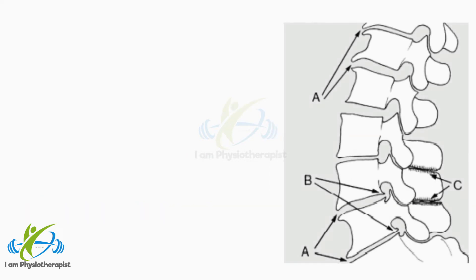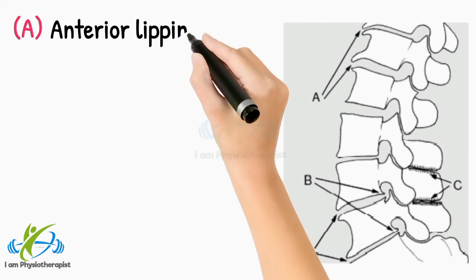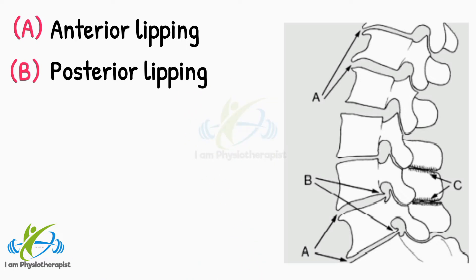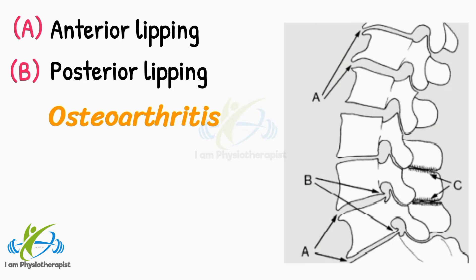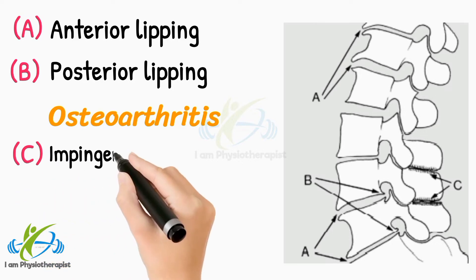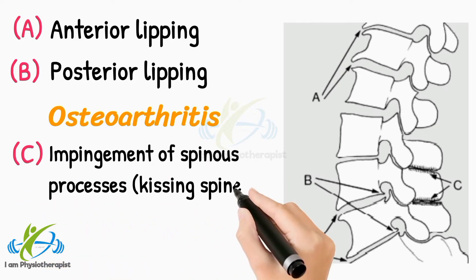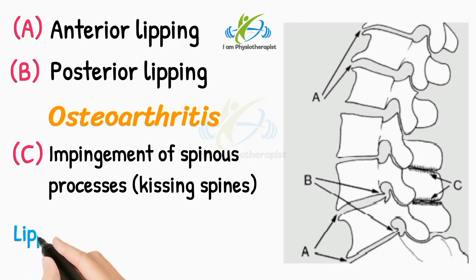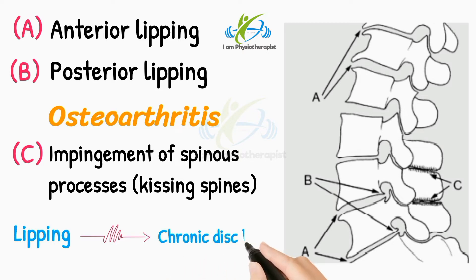In this radiograph, point A shows anterior lipping; point B shows posterior lipping. Lipping is also the main feature of osteoarthritis. At point C, note impingement of spinous processes — kissing spines. Lipping is seen in chronic disc lesions, mainly at L5-S1, but also at the other rarer disc prolapse sites.